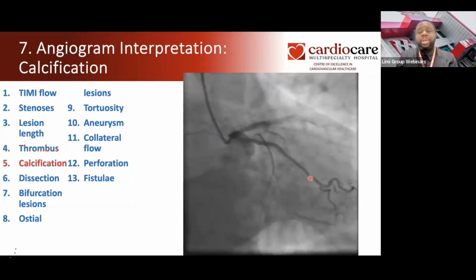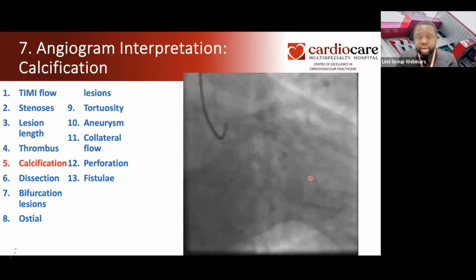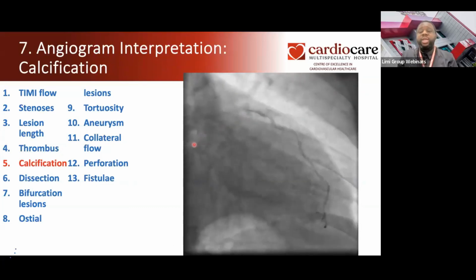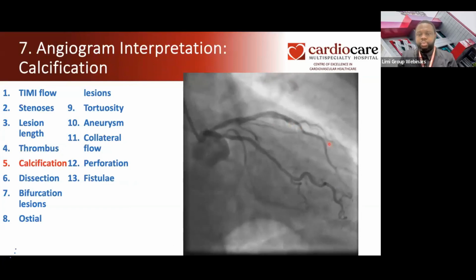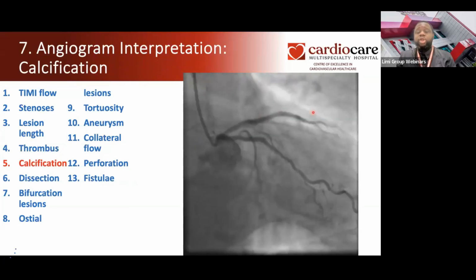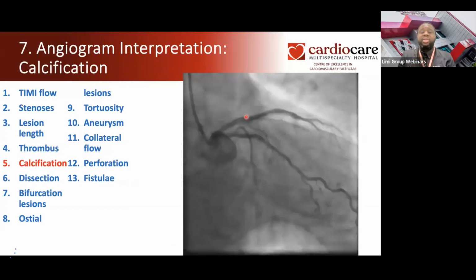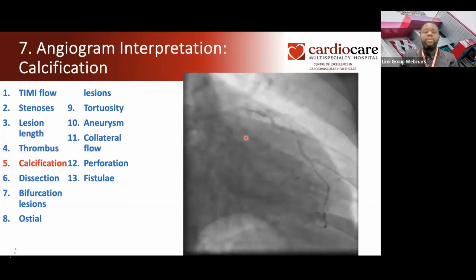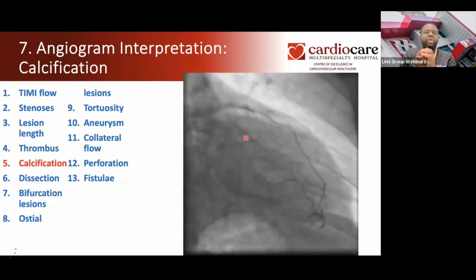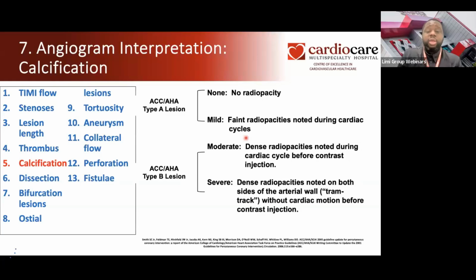All right. So sometimes we also have calcification, which is, I don't know if it's very clear, but if you look at this video, even before the dye comes, you can already see the blood vessel. After the dye, you can see the blood vessel already showing. That is severe calcification, showing even before the dye. We have many patients like this. They have severe coronary artery disease for a long time. The vessels are calcified, and even before you do anything, you're already seeing that.